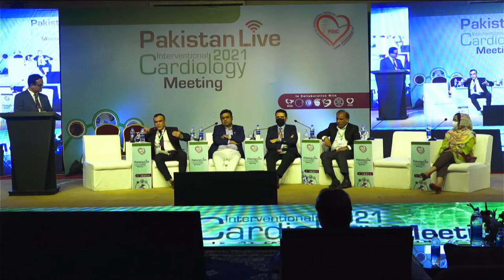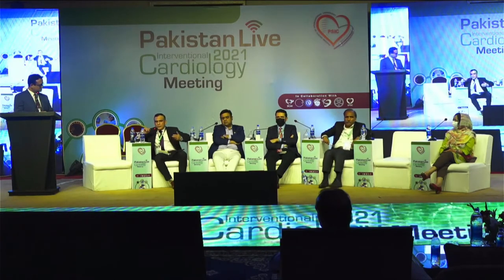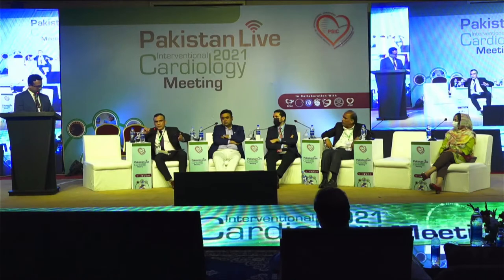I think the imaging issue, with the cost that we have, the only thing is if there's a complication or if there is a doubt about something, about plaque or sizing or dissection versus some other hematomas and things, that is where imaging must come in. But for post-stent optimization, we always do it with 4 or 4.5. Now we got used to it.